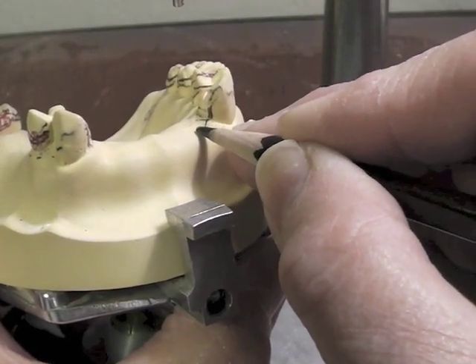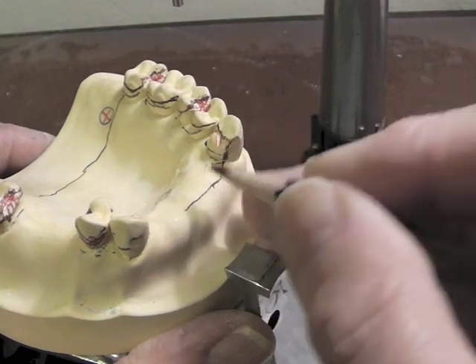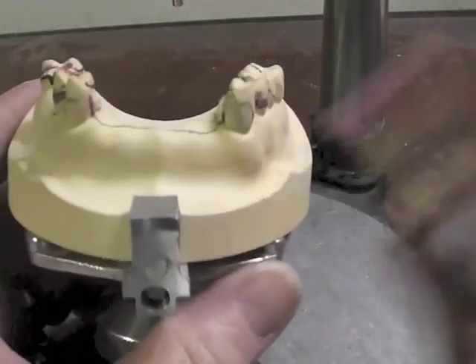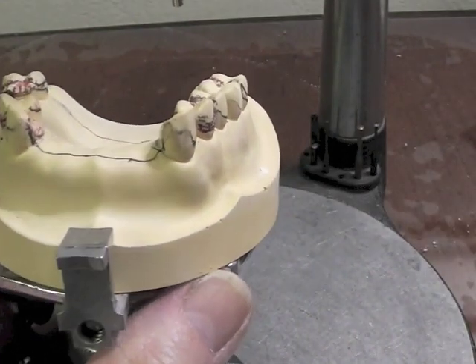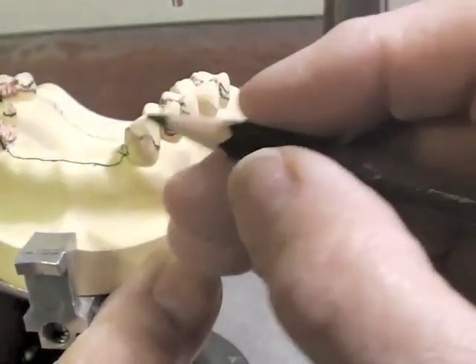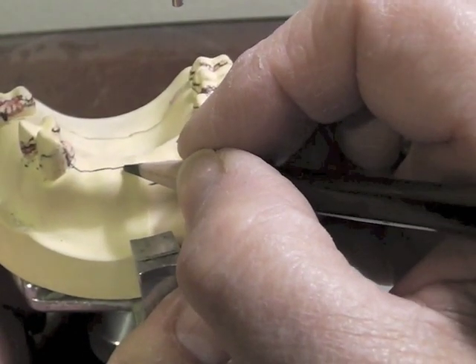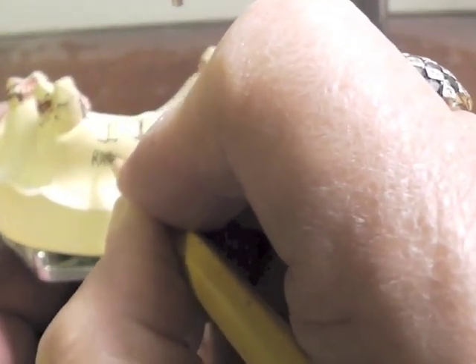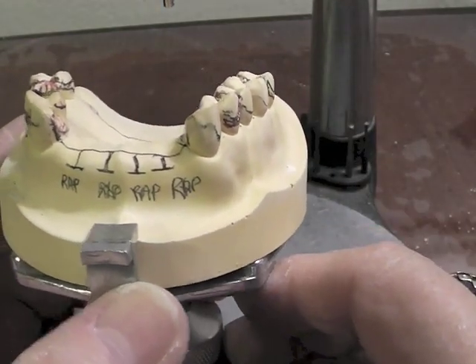Wraps are probably not as good if you have a really deep vertical bite, but they are very aesthetic. The way we draw a facing or a wrap is that we come down at the guide plate area, come straight across the ridge, and go back up to the guide plate area on the opposing side. If we were doing facings, we would put four F's out here on our cast. If we're going to do wraps, we'll put RAP, one for each tooth. The wrap has an additional component — a little T that comes out here — and we place one for each tooth. Then on our cast, we're going to label it Reinforced Acrylic Pontic: RAP.